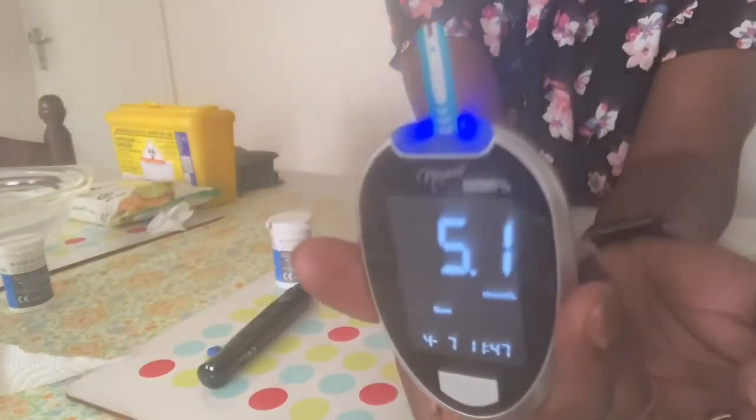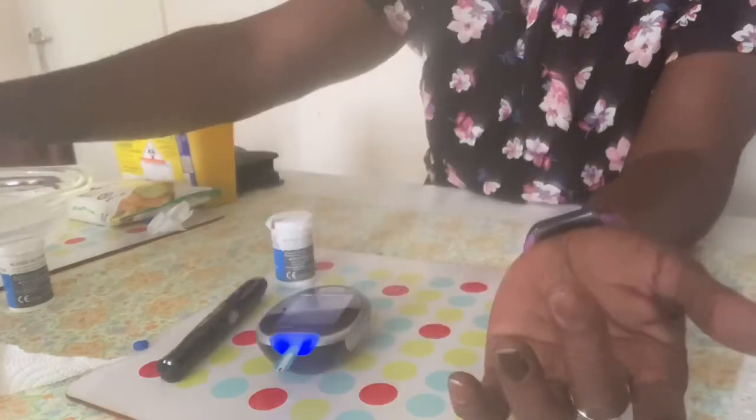Take your meter with the test strip and hold it against the drop of blood. It will tell you when the test strip is filled, usually with a beep. Before you look at your reading, check your finger.